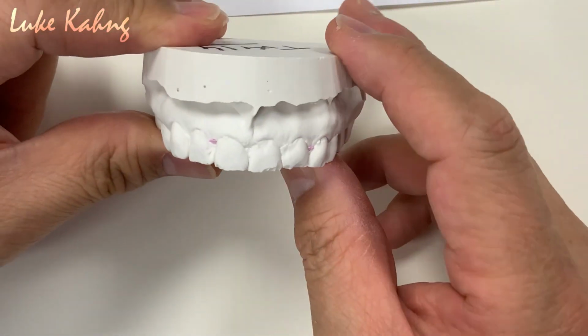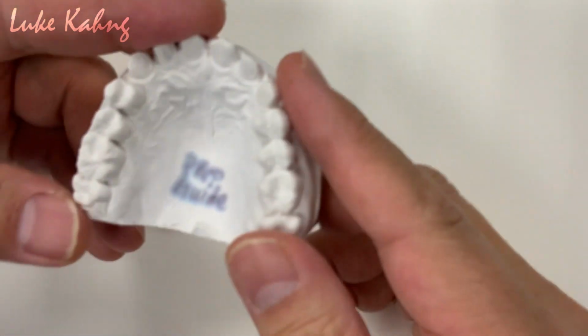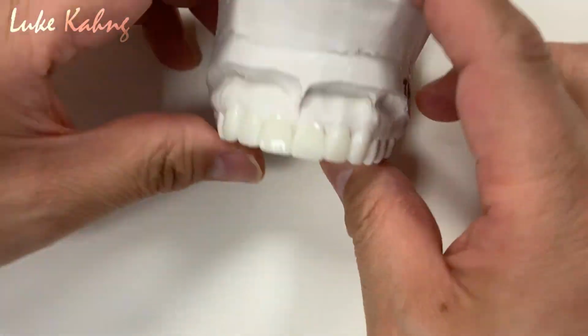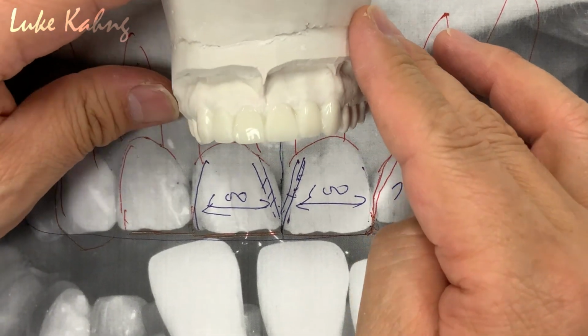So that being said, this is the before, and this is the lower. We prep the teeth, and then let doctors know, prep guide. And also we make the treatment plan wax up, just exactly what I said, just like this here. But this we call test drive.